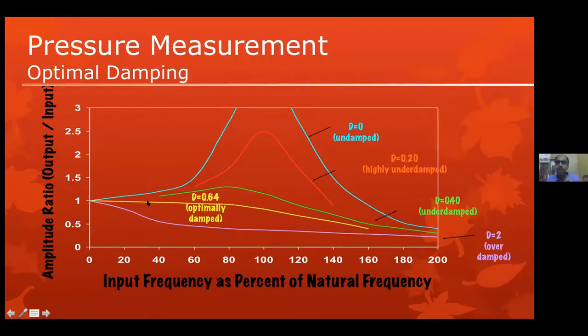So in other words, it will not be possible for us to see a C wave, a dicrotic notch, or a left ventricular end diastolic flick on an ICU transducer, but in a cath lab transducer we will be able to see them, because the cath lab transducer's natural frequency will be much higher and the ICU transducers will have a much lower natural frequency, and when it is much lower, the frequency response, that is the box of area where we will be able to record, will be shorter and shorter. So this is basically the principle of this curve.